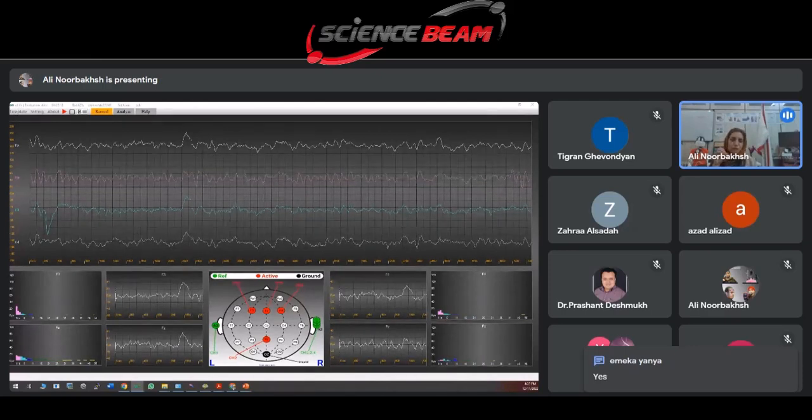After that, we should select the evaluation 19 channel because there are a lot of protocols in this list. Evaluation 19 channel is related to QEEG. There are protocols such as evaluation 4 channel, evaluation attention index, and so on.